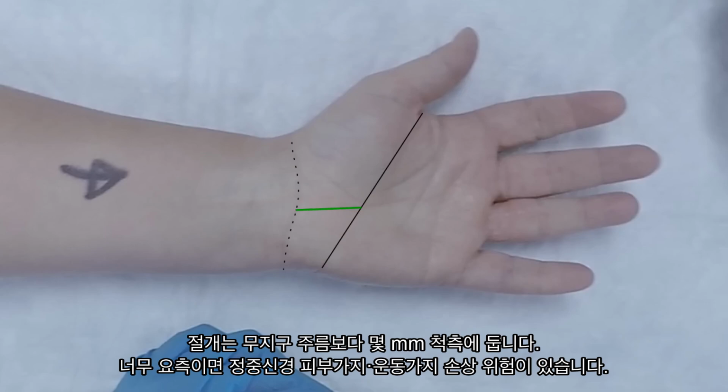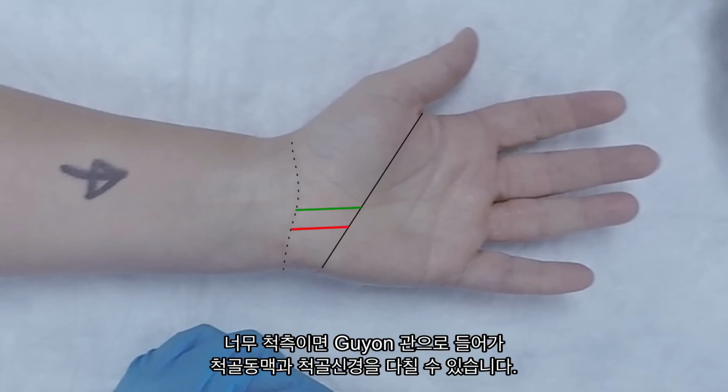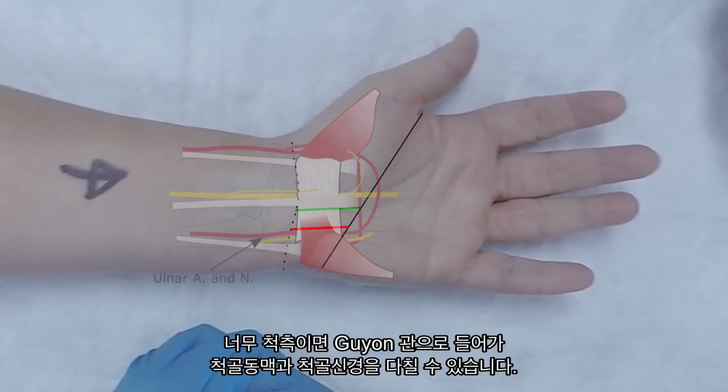If our incision is too ulnar, we may end up in Guyon's canal, risking injury to the ulnar artery and nerve. Great, so now we know where our incision will be and why. Let's move on to the next step.